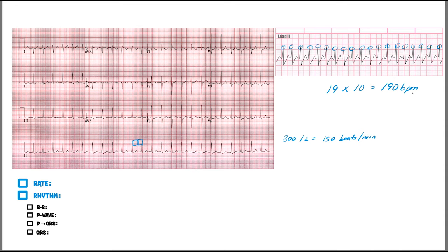So our rate is about 150 beats per minute. Next, we determine the rhythm by looking at the R-to-R interval on the rhythm strip, making sure the distances are about the same. Marking points along the strip, I get about two boxes consistently between each contiguous R wave. As I move throughout the length of this EKG, they're definitely two boxes consistently — so this is definitely a regular rhythm.